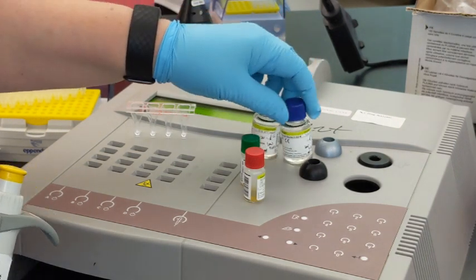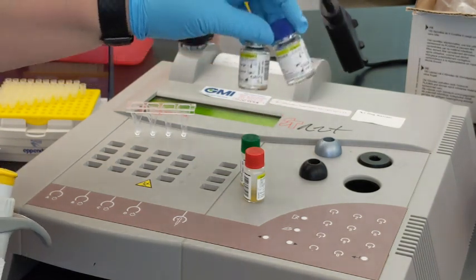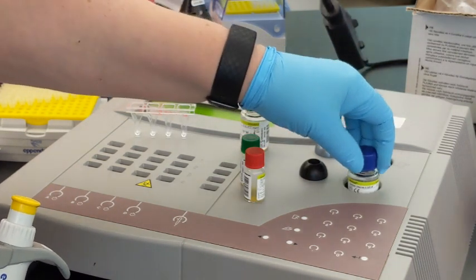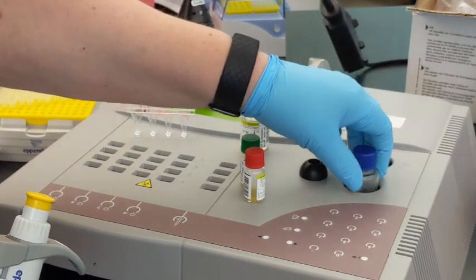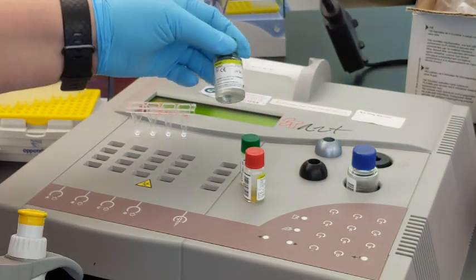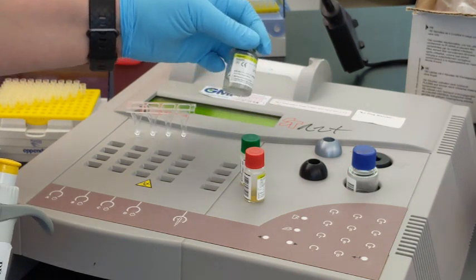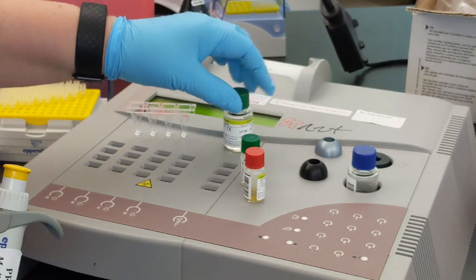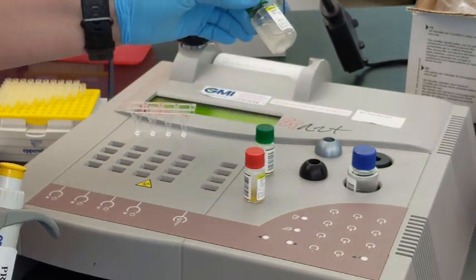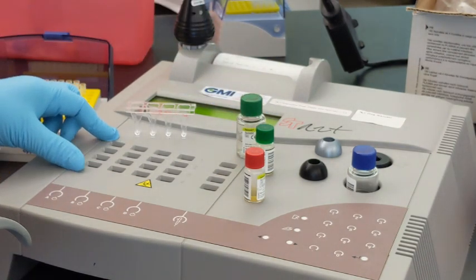So for the PTT test, I guess because there's two T's, there's going to be two reagents. The calcium chloride is the reagent that will go into your 37 reagent heating block, which is going to heat it up to 37 degrees. And what's different than the other tests that we would typically do as a screening test is that we're going to be adding the patient or control into our cuvette and then our reagent and allow it to incubate for a little bit of a longer time.